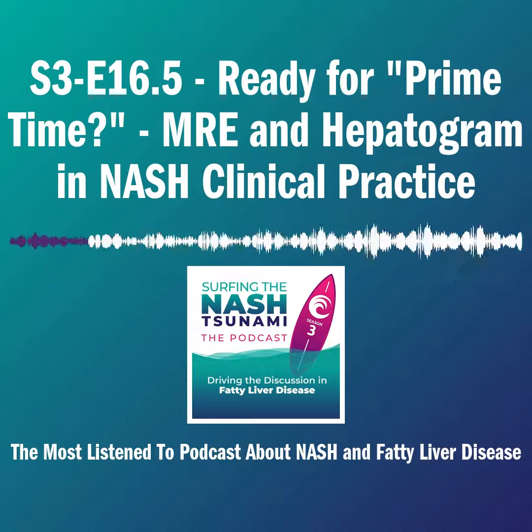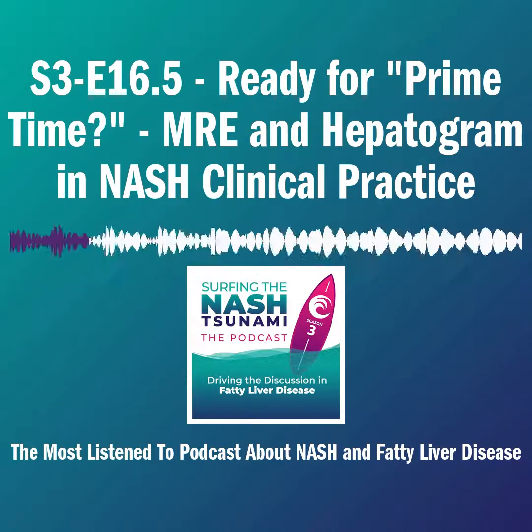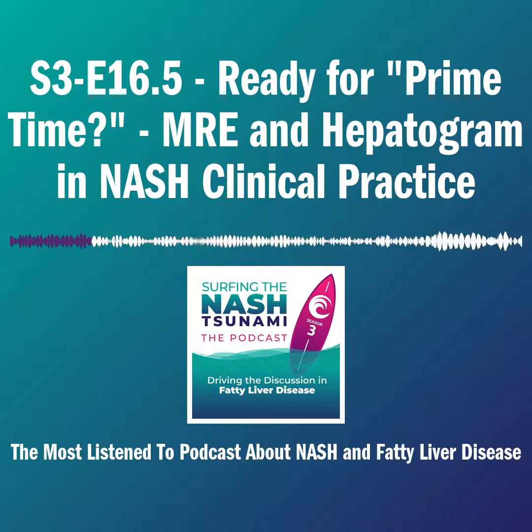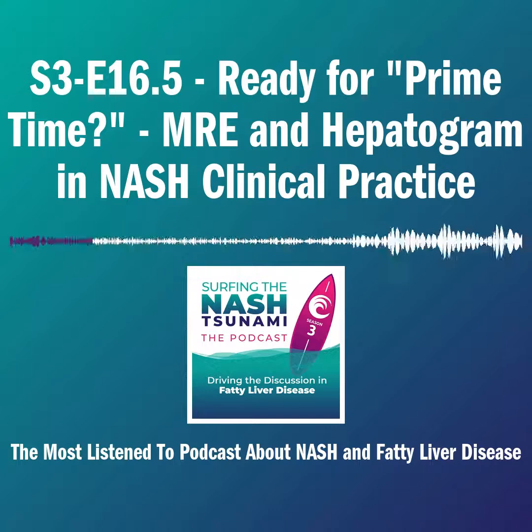Back when I was in San Diego, everyone was saying PDFF is expensive, MRE is expensive, it's going to be very costly to our system. And I mentioned to Scott earlier that he wrote a paper about the Medicare cost of it and how it can be done as just a limited abdomen test without a contrast and be cost effective. And it's not that expensive if it's tailored well. So I started doing MRE as part of my clinical practice.